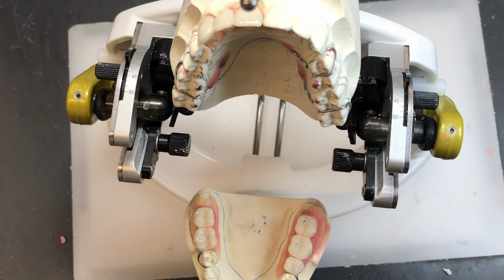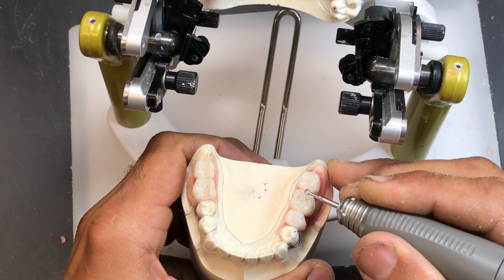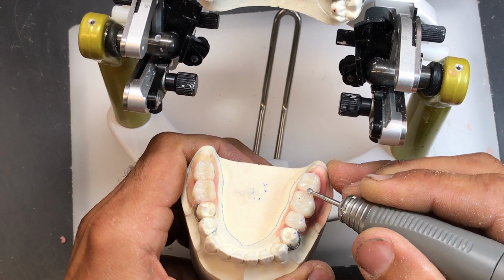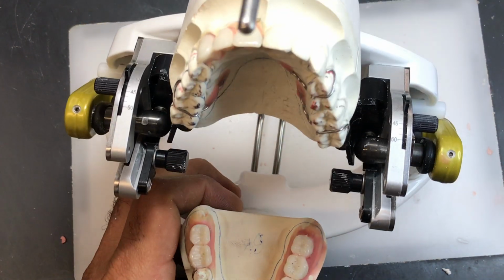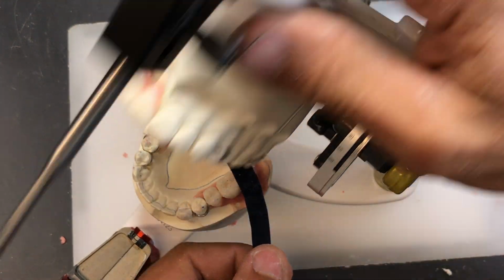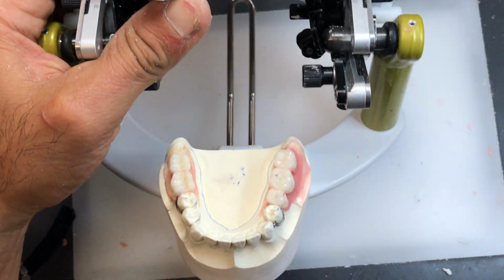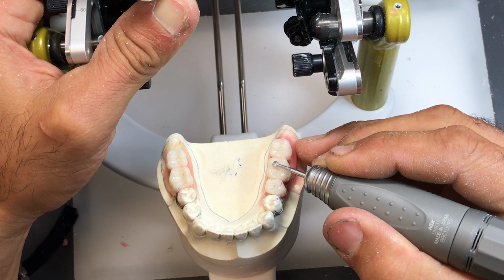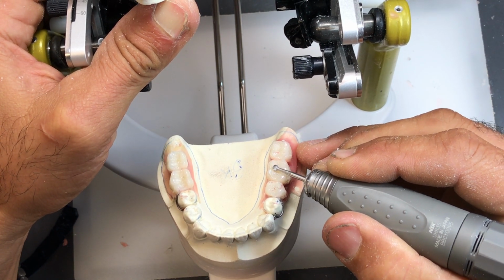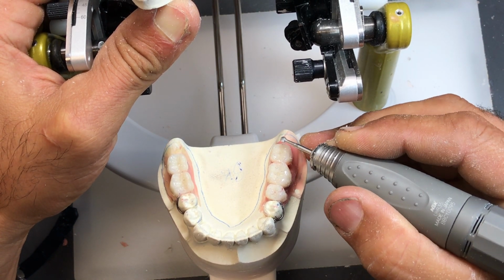Oop, wrong burr. We can see a premature contact on the distal lingual incline of 3/7, so I'm going to take that out. Maybe a little bit here because I shifted this tooth around as well. Now I'm going to reverse back to the red portion of the paper. And now I can see a bit of a contact here because I moved it towards the buccal. Makes sense. And a little bit here and there.